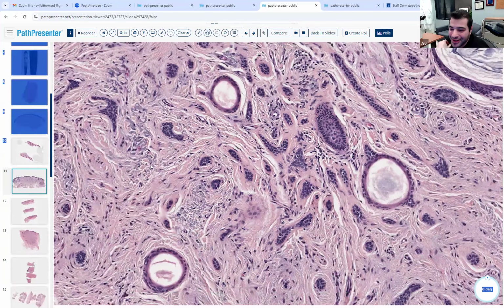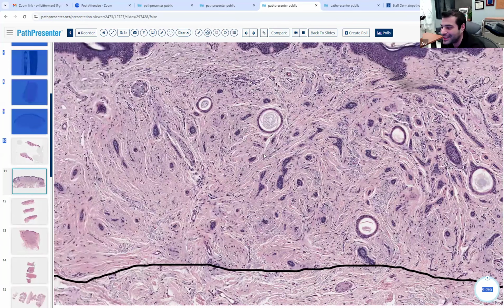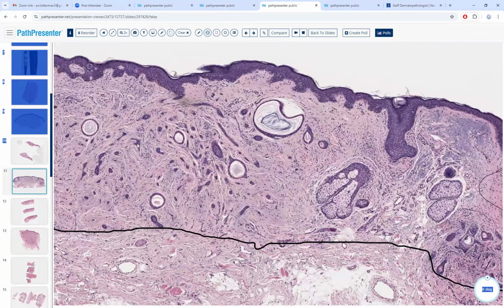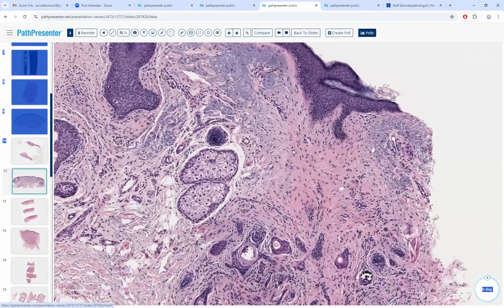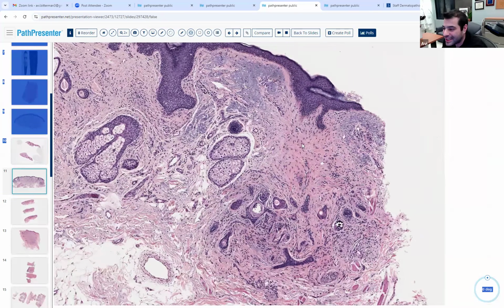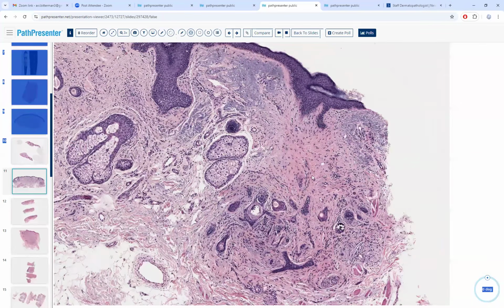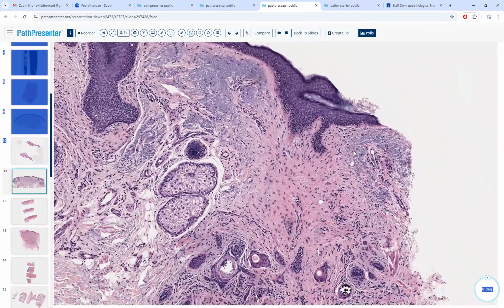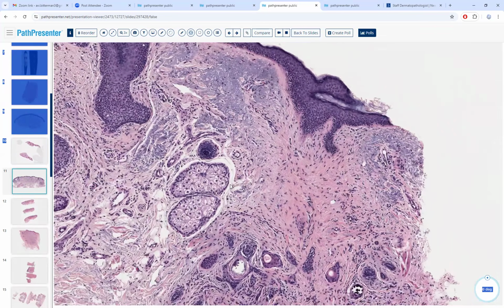I don't know if Shane has a better way of explaining desmoplastic. No, I think that's good. Desmoplasia implies increased collagen, and fibrosis usually, the way you originally defined it, implies that there are increased fibroblasts, and in this instance there are, but sometimes with desmoplasia you don't see so many increased fibroblasts. But you're right, increased collagen may or may not have an increased number of fibroblasts. Yeah. The only way for me to have known that would have been to have the comparison of the solar elastosis to the new increased collagen, right? I would have had to know that point of reference.